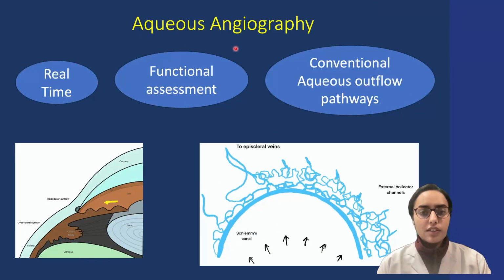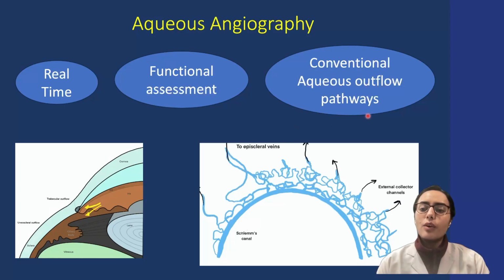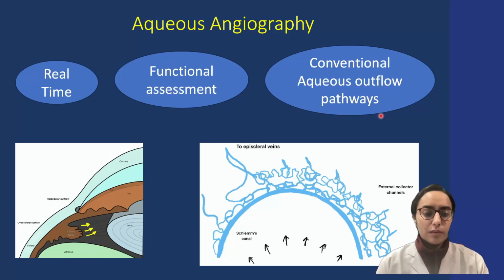Aqueous angiography is a recently introduced technique which allows for real-time functional assessment of the conventional aqueous outflow pathways in vivo and under physiological conditions. Let's quickly revise with the help of these animations.